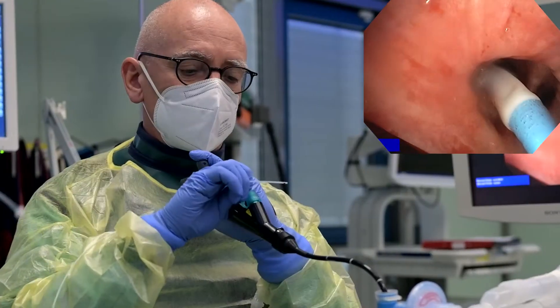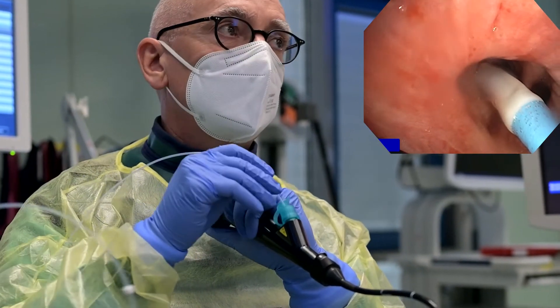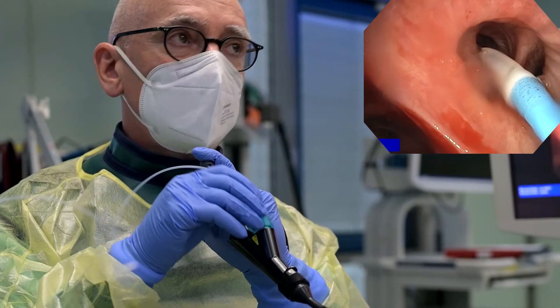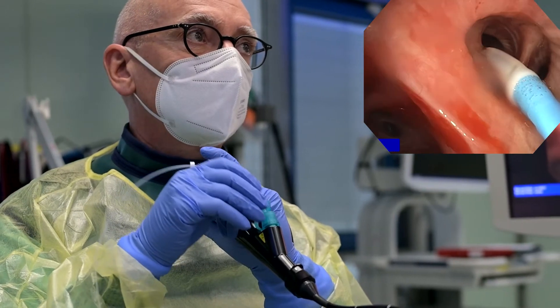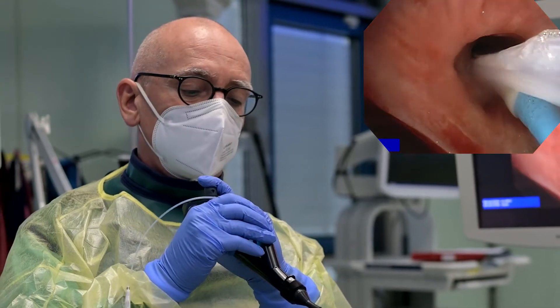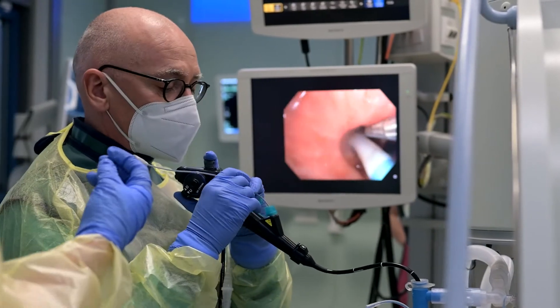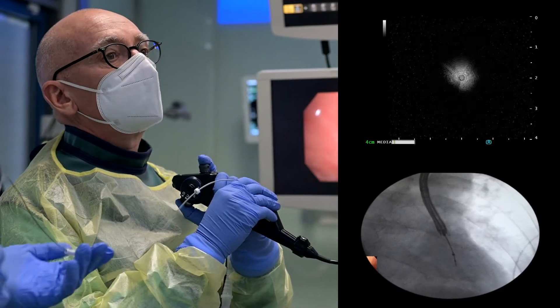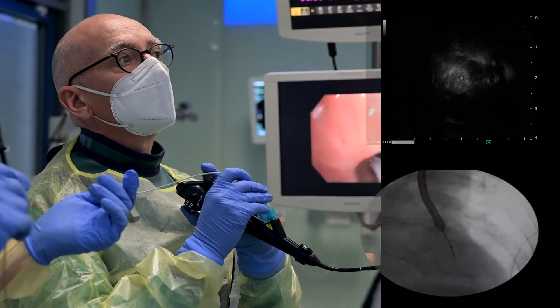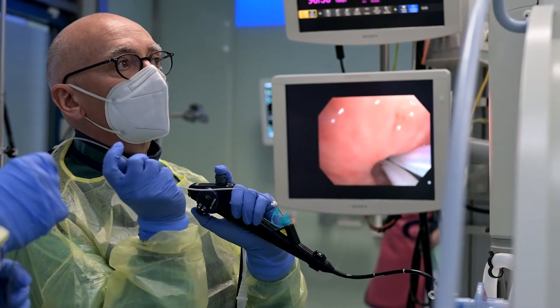For nodule localization, the guide sheath is inserted through the working channel and advanced to the region where the nodule is located. The radiopaque ring around the tip helps to visualize the distal end under fluoroscopy. The radial eBUS probe is then inserted into the guide sheath. Following sonographic confirmation of placement in the lesion, a fluoroscopy image serves to illustrate this position in relation to the distal end of the guide sheath as marked by the radiopaque ring. The radial eBUS probe is then extracted while keeping the guide sheath in place.